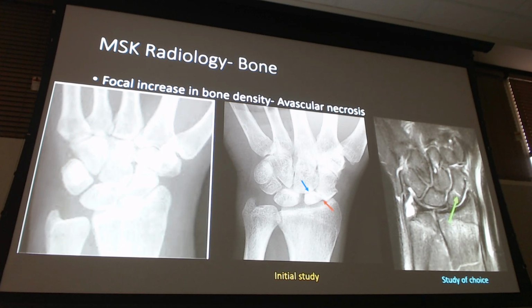So this one I like because it starts off again with what is a normal x-ray. Following all of my carpals, everything looks right. I do my cortex, I do my medullary, I jump into my joint spacing and my joint alignment. Look at all that, everything looks good.